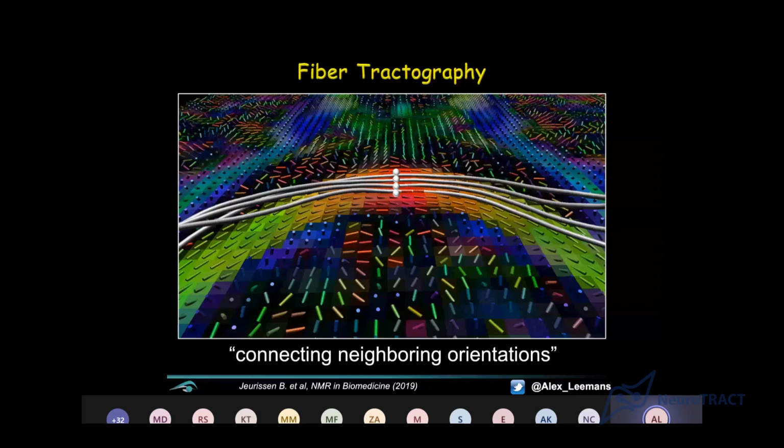It means that at that region, the assumption is that if the FA value is low, if the anisotropy is low, it basically reflects that there's no clear preference in orientation of your diffusion. Again, in turn, reflecting maybe that you're entering a region of CSF, right?